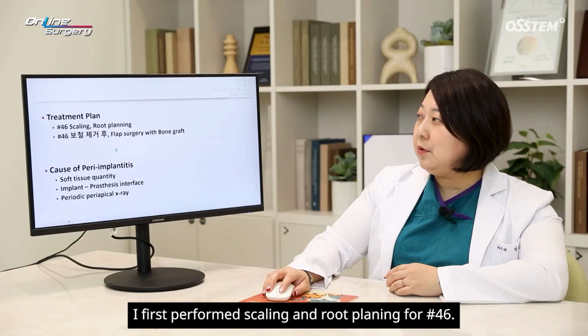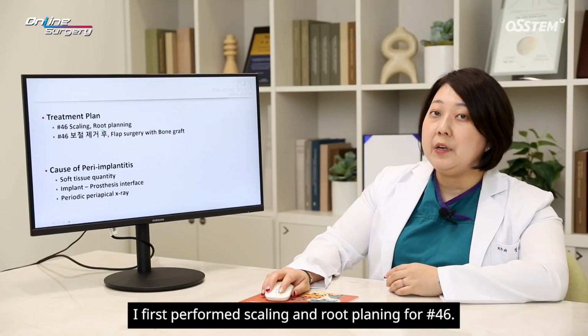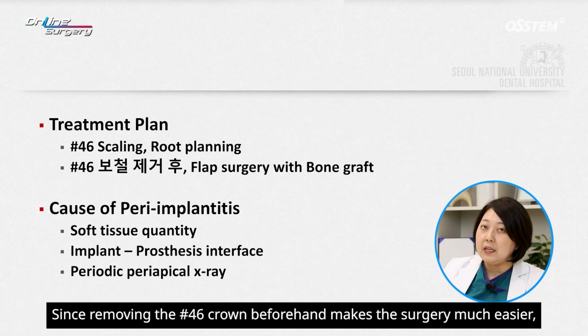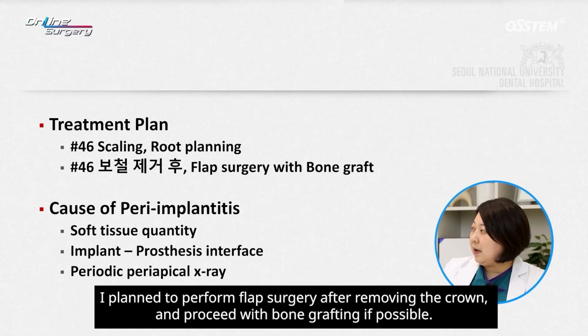I first performed scaling and root planing for number 46. Since removing the number 46 crown beforehand makes the surgery much easier, I plan to perform flap surgery after removing the crown, and proceed with bone grafting if possible.